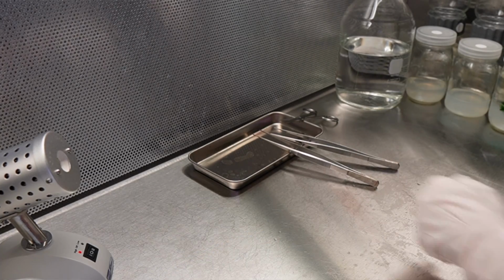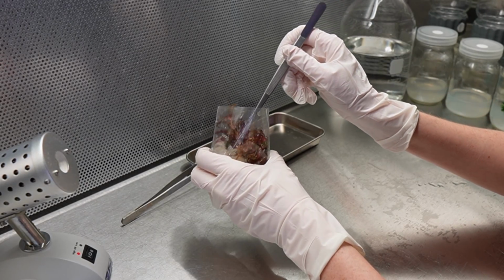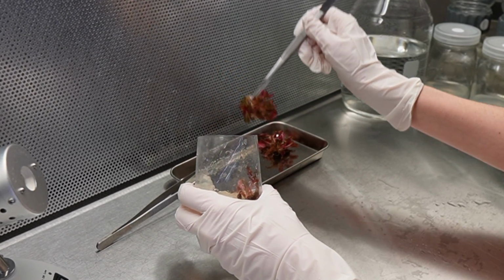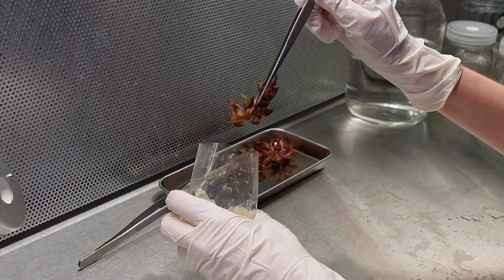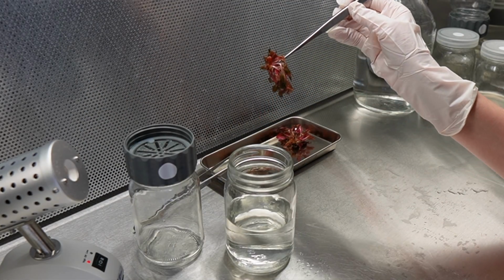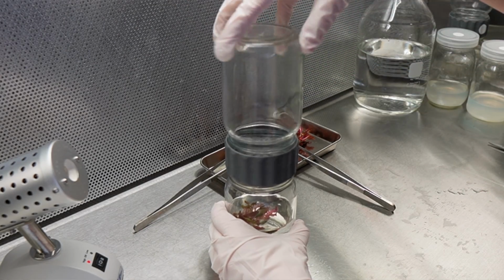I adjusted the pH to about 5.5 because I read that aquatic plants prefer a slightly lower pH compared to the tropical ornamentals that I typically work with. The solid media for my weird freak experiment contains half-strength MS, 30 grams per liter of sucrose, 0.5 milligrams per liter of BAP, and 0.1 milligrams per liter of NAA, both of which are plant growth regulators.